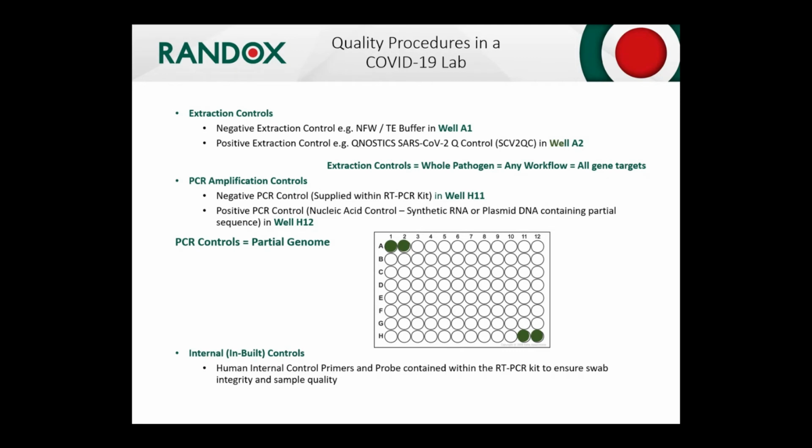That's important because there are multiple different concentrations of samples supplied with your analytical panel. The reason the panel consists of a numerous number of samples is to cover the dynamic range of most of the assays that are out in the market in a linear progression. It's also important to note that any diagnostic samples which may be used within a laboratory setting are treated like a patient sample, under the same circumstances as a clinical sample would be run. So they would behave in the same way as a patient sample? They would. The material that we have worked with is commutable to a human sample, which essentially means it's clinically significantly the same as what you expect from a clinical sample.